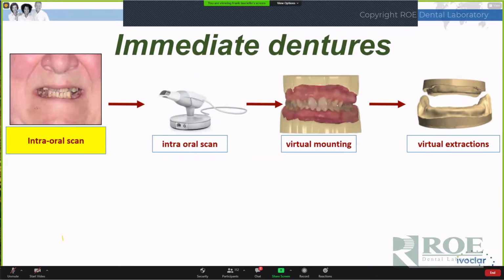Yeah, we could also do an intraoral scan, gaining a lot of popularity, especially amongst the younger of us who are a little more advanced in the sense of this digital technology, because they played more video games, I guess, than we have.